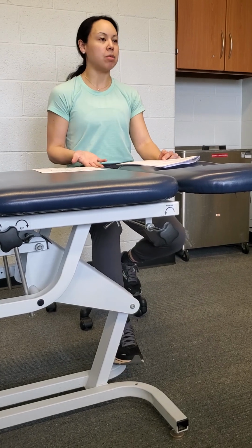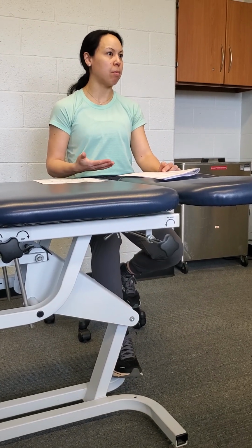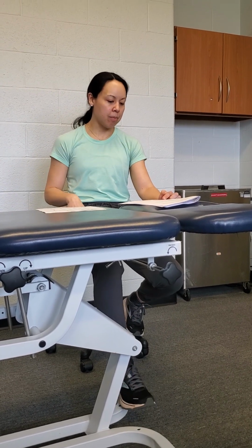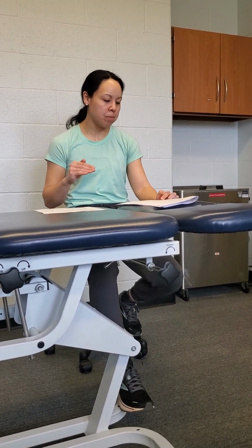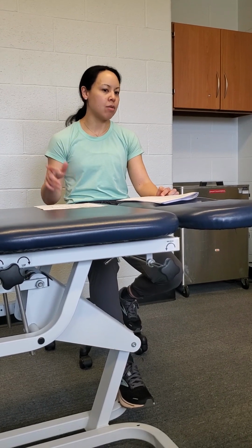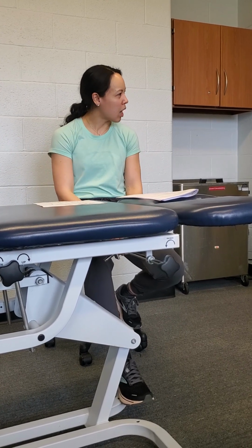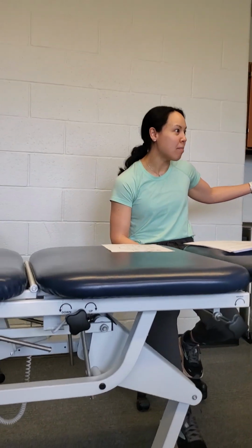Have the subject sit up to temporarily increase their blood pressure, and then have them lie back down and retest. Or you could even have them perform some isometrics, like some quad sets, and then retest, because sometimes the patient is cold when they come in. They could even do a 10-minute warm-up on the bike, and then come over, lie down, and then hit the button.